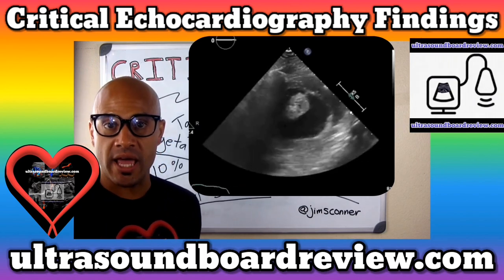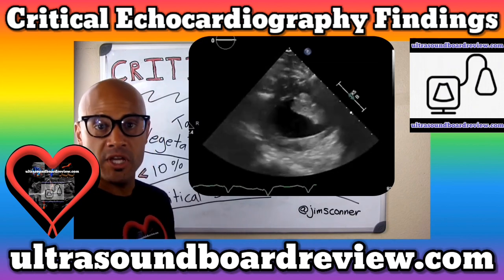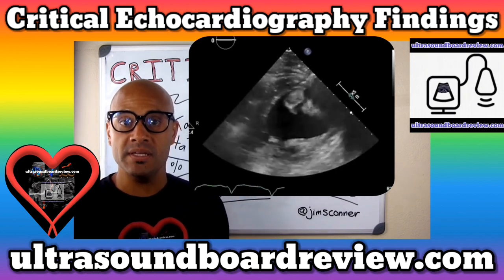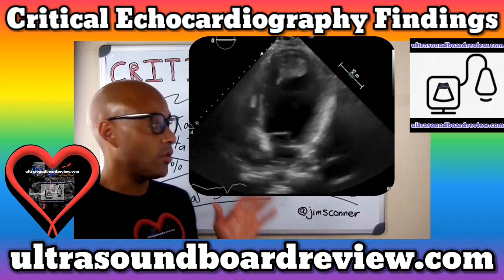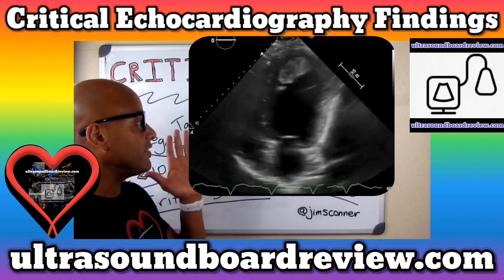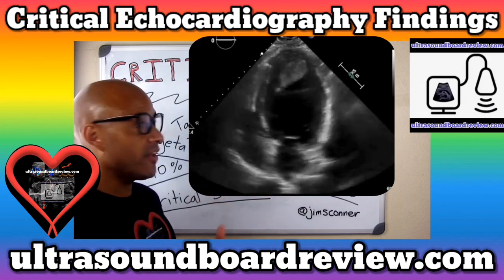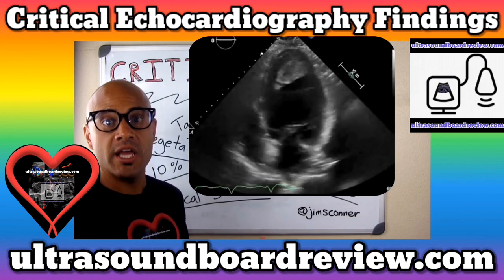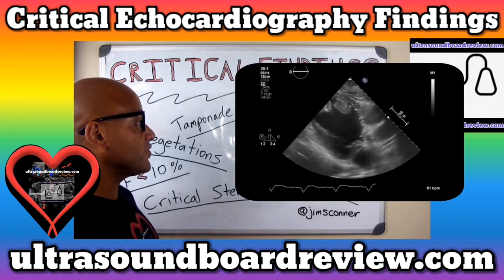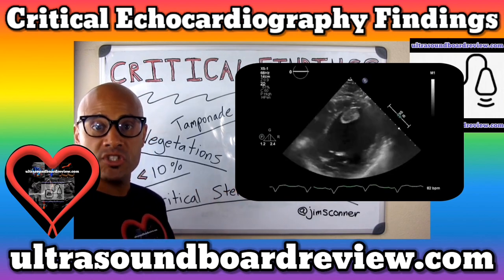You just started your exam — do you run out of the room and call a doctor, or do you start measuring the left ventricle in the minor axis? The first step is to break protocol. In this case, you're going to move to different views to see if the structures in the left ventricle will go away or not. If it's an artifact, chances are it won't be there in other views. So we go from the parasternal long axis view to the short axis view, and then to the apical four chamber view.